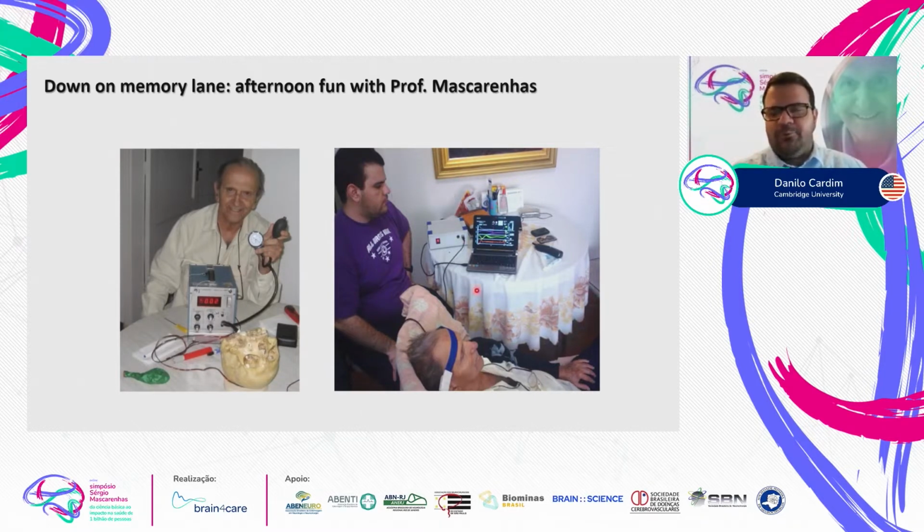Back in the days, we were still prototyping this technology. As we can see here, we had a very old, blocky device that served as our signal capture platform, connected to a laptop where we could see different signals and different extractions that we performed for data analysis.